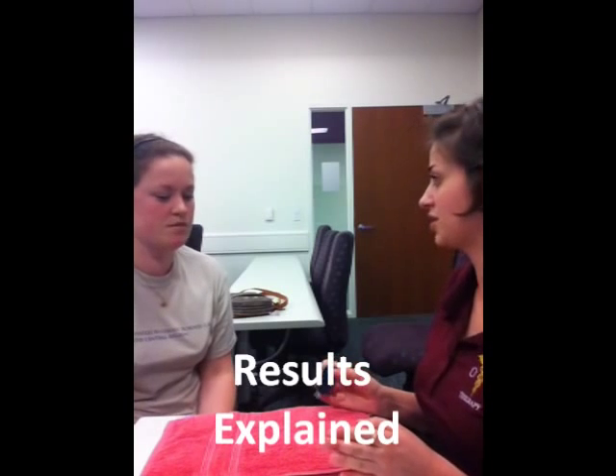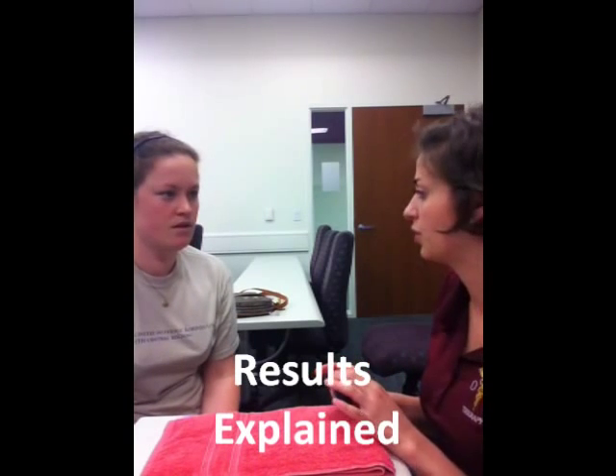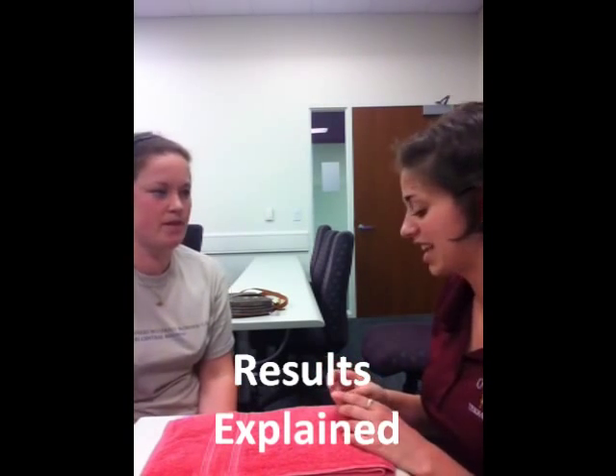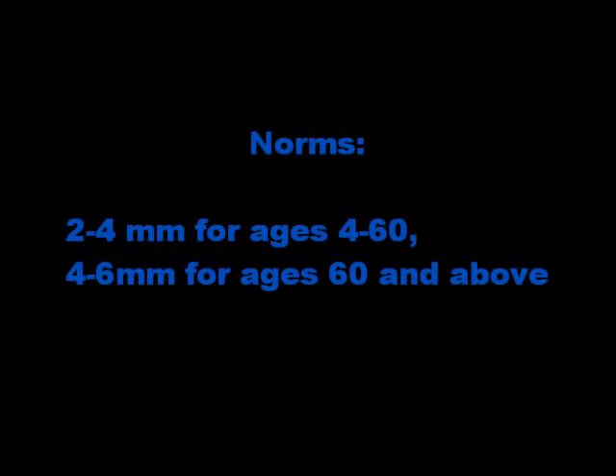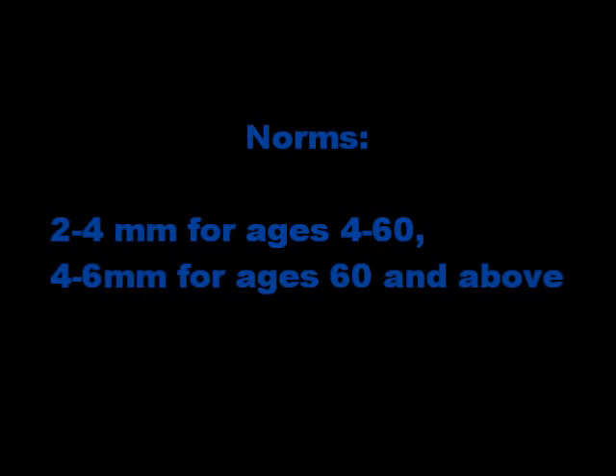Okay. So it looks like up to five you were able to distinguish very clearly, and then once we hit the four distance it was a little bit difficult. And that's okay — about two to four is the range for someone your age, so it makes sense that around two things get a little bit different. But thank you so much for all your work today and things seem to be going well for you. Let me know if you have any problems. Thank you.